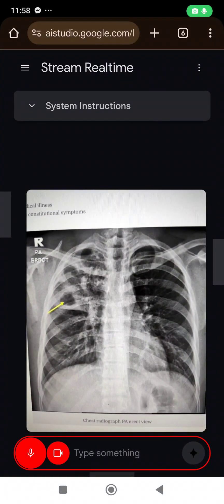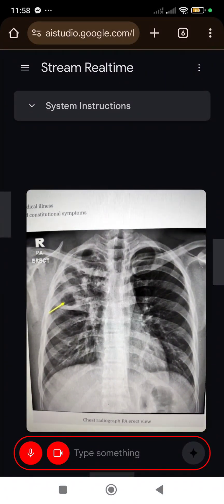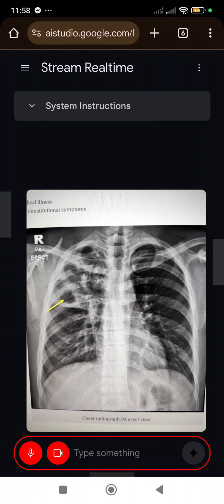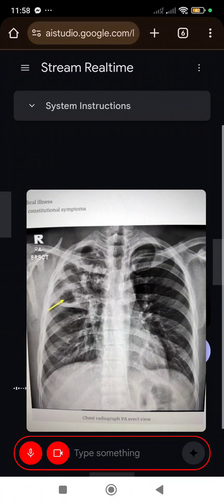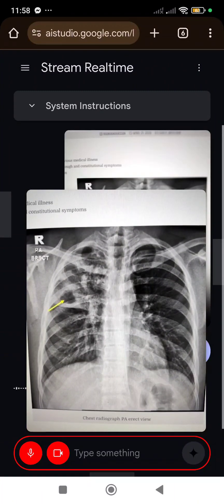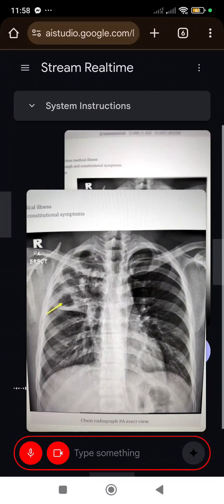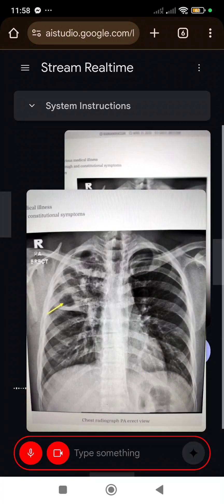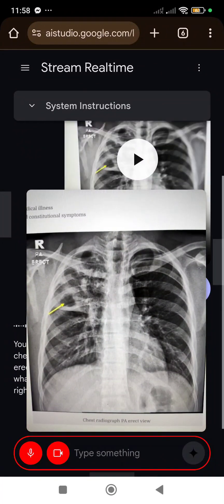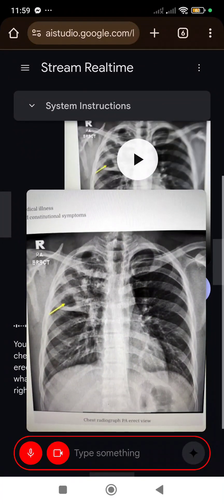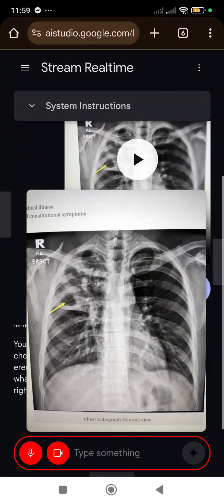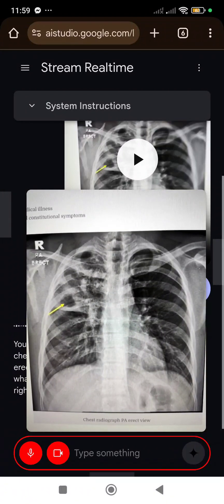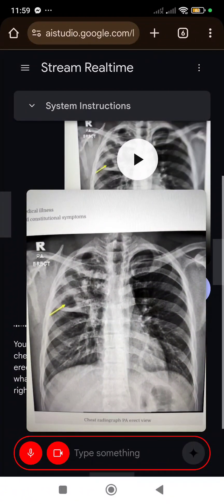Hello, what am I looking at? You're looking at a chest radiograph, also known as a chest x-ray. This particular image is labeled as a PA erect view. I can also see a yellow arrow pointing to what appears to be an abnormality on the patient's right lung.